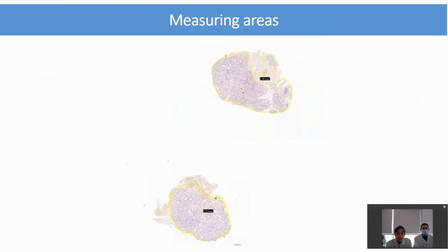For accessory salivary gland biopsies, the grade of chronic sialadenitis lesions is determined by the number of lymphoid foci per 4 square millimeters. Accurate measurement of the glandular parenchyma area is therefore essential for diagnosis and can be easily and precisely evaluated on digital slides.